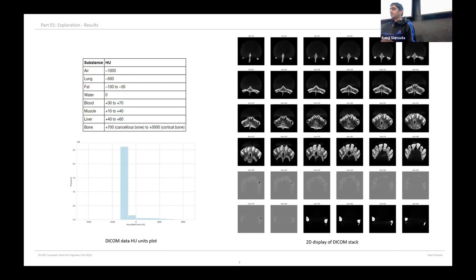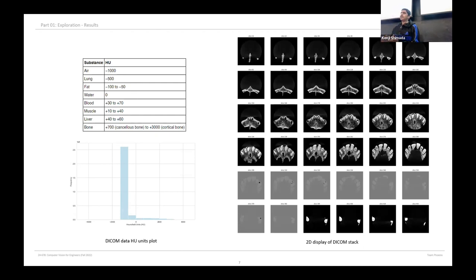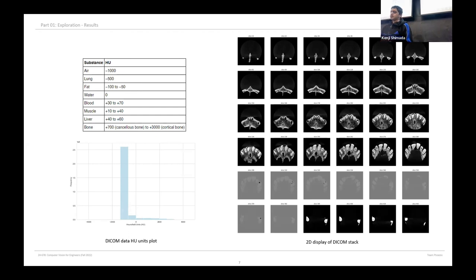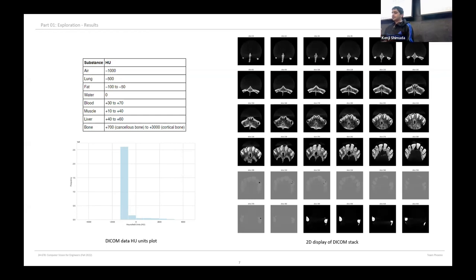A single DICOM layer does not contain enough information to visualize the 3D structure. As every DICOM layer has some associated depth with it, it becomes absolutely necessary to stack multiple layers over each other. Here on the right side, you can see the subplots and the generative transformation of how multiple layers are stacked over each other, giving us progressive information of how the dental images are generated.